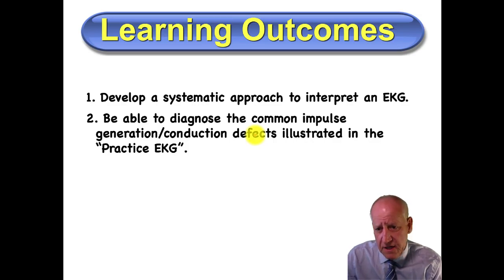And by the end of this session, you should be able to diagnose the common impulse generation or conduction defects that will be illustrated in the practice EKG. There are about 9 EKG disorders illustrated in this practice EKG, and I think that you'll be able to diagnose each one of them without too much difficulty.